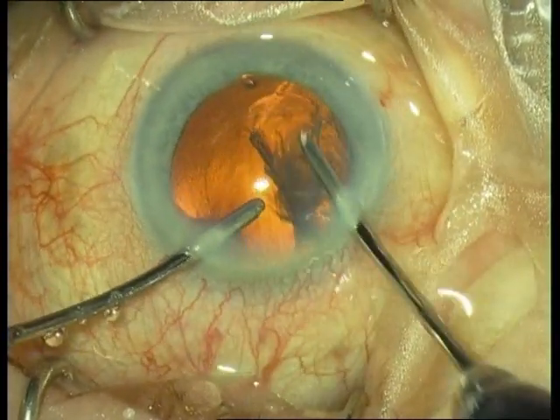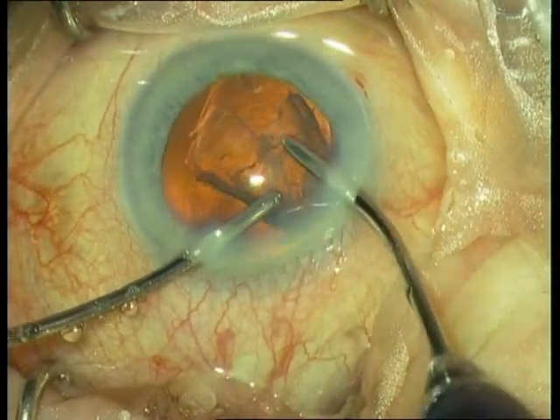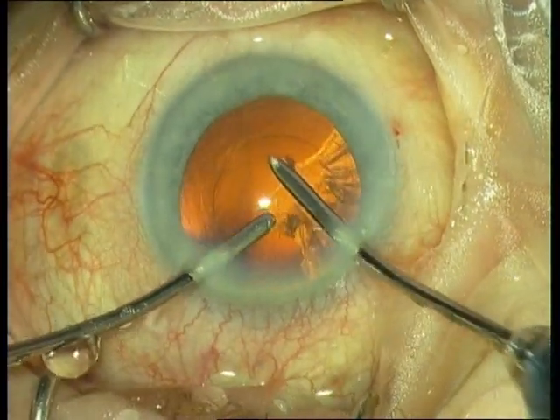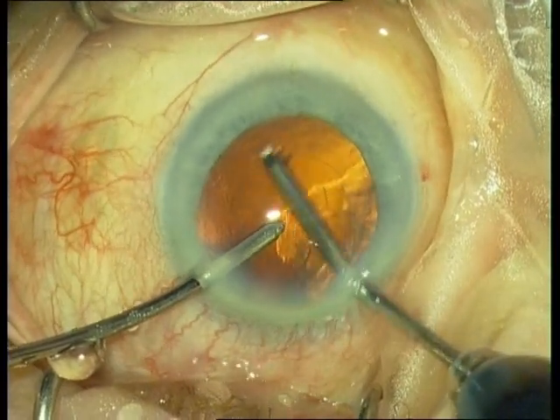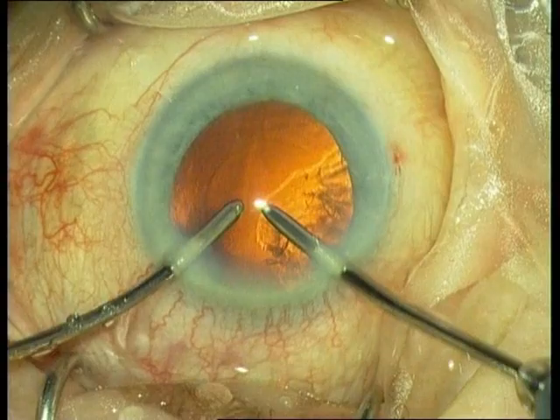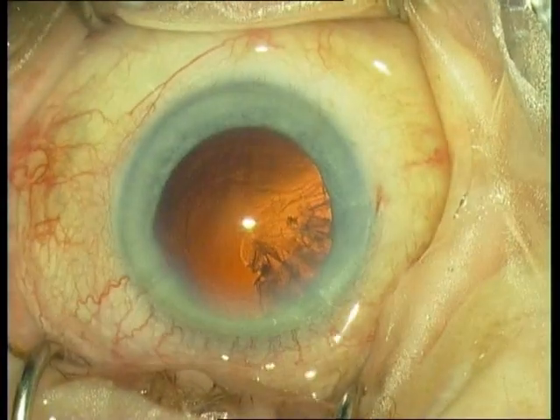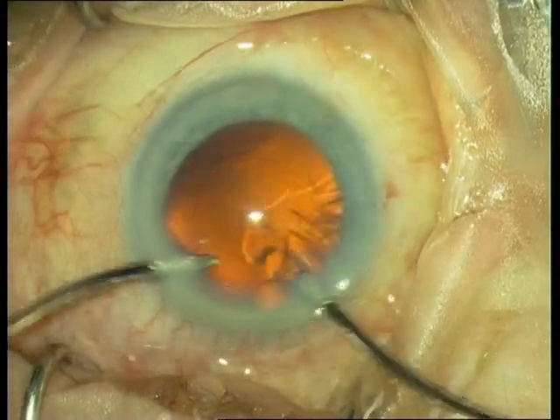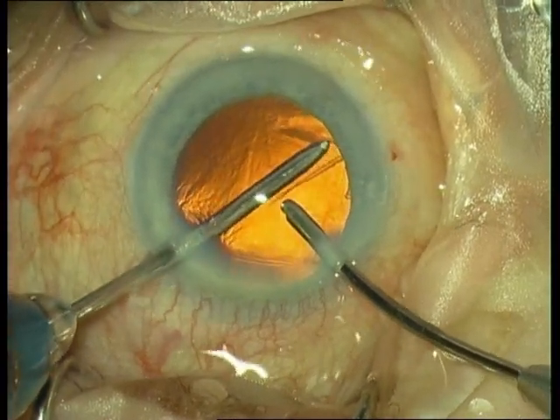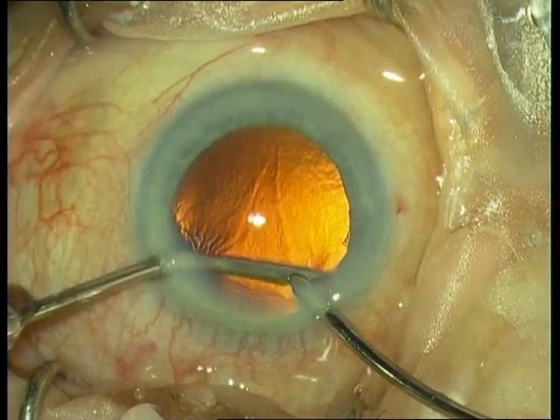The irrigation handpiece helps the aspiration handpiece if a fragment gets stuck inside the opening. A little polishing of the anterior capsule is performed, which is not strictly necessary, but it reduces fibrosis.